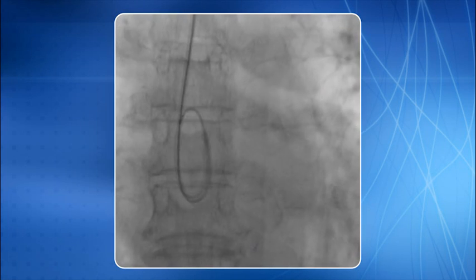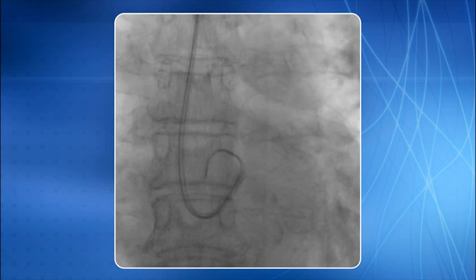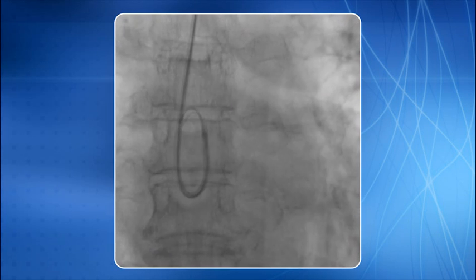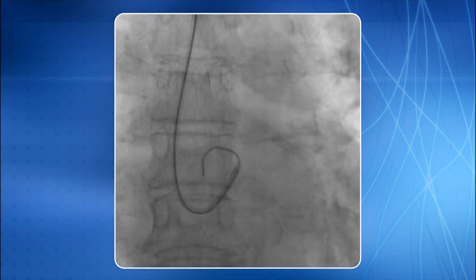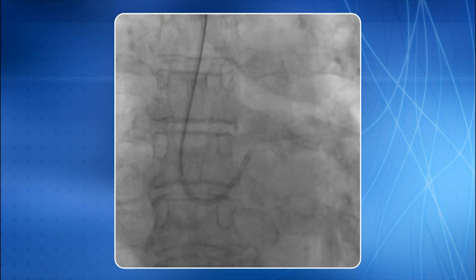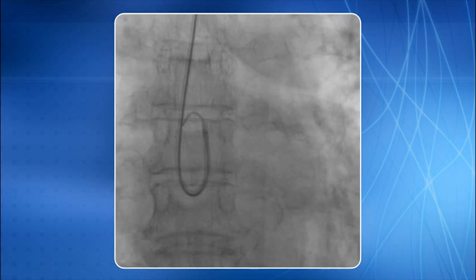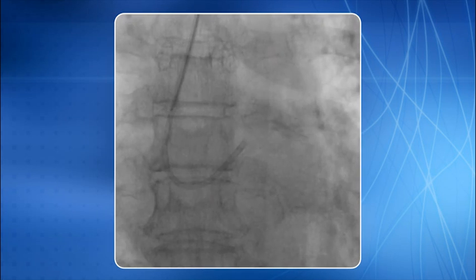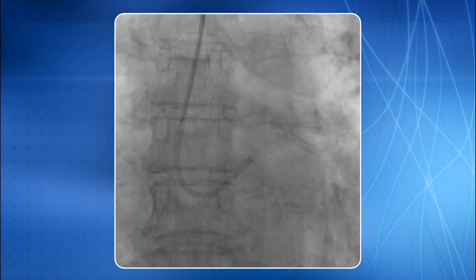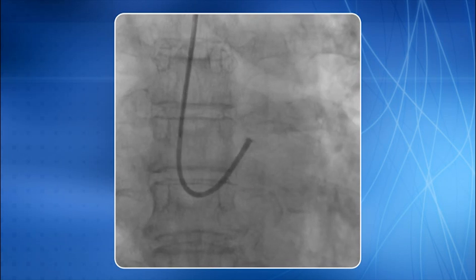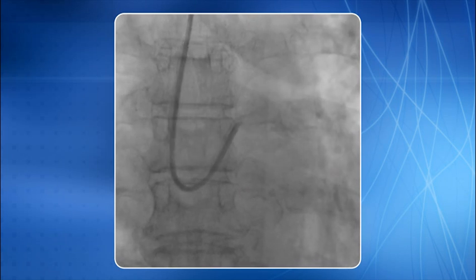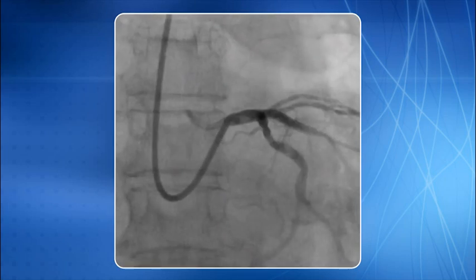This is another technical modification to cannulate the LCA with an extra backup guide. The guide is brought into the ascending aorta and unfolded with the wire. A slight counter-clockwise rotation with gentle pullback cannulates the LCA ostium. LCA injection is done.